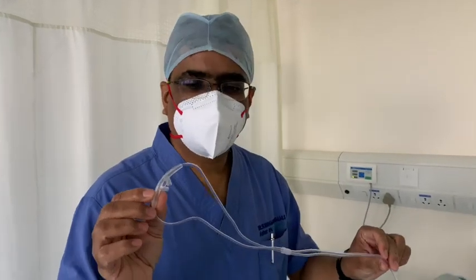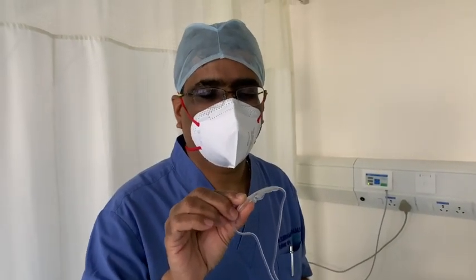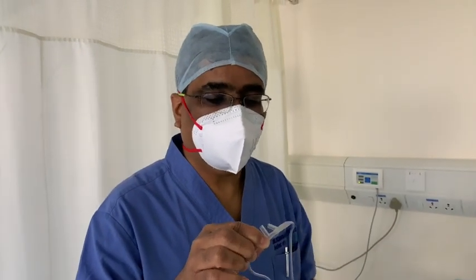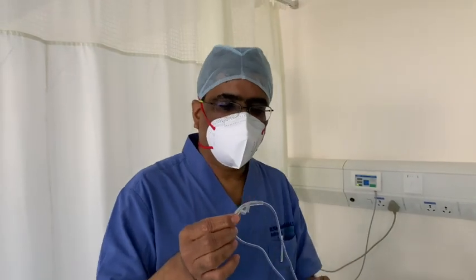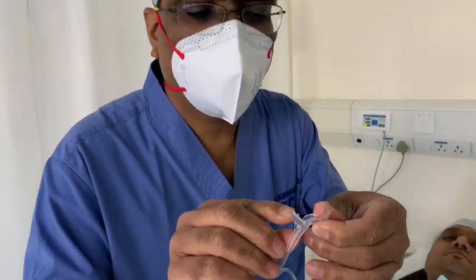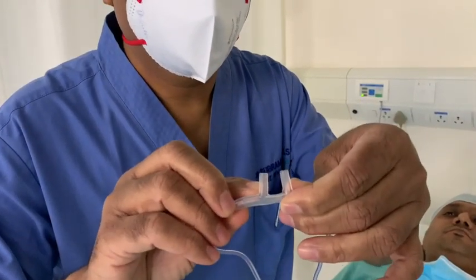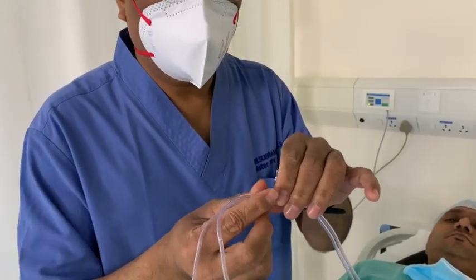This device is called by various names: nasal prongs, nasal catheter, or nasal specs. You can see there are two small ports here — each one goes into one nostril — so it can easily go into both nostrils of the nose.